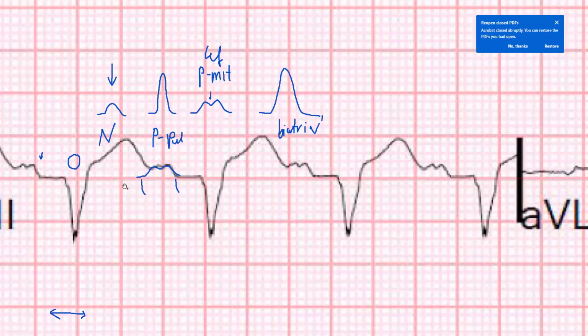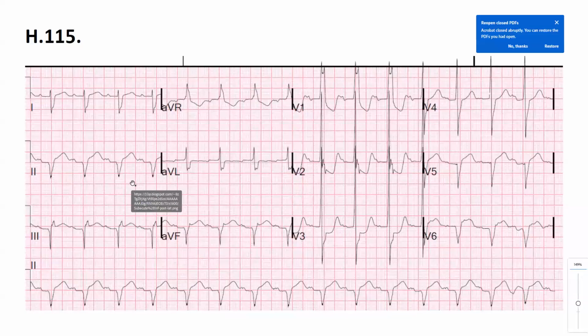So we do have a left atrial enlargement, okay? Good. Next one, PR interval. It's less than, oh no, sorry. I look at lead II, okay. Looking at lead II, it's more than 0.2 seconds, so what does it mean? It's elongated, prolonged. And what does it mean?